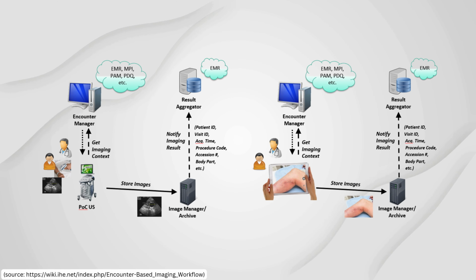Images generated through encounter-based imaging workflow should work the same as radiology images captured in the traditional order, acquire, and send to a PACS. It should be the same as if the clinician placed the order.